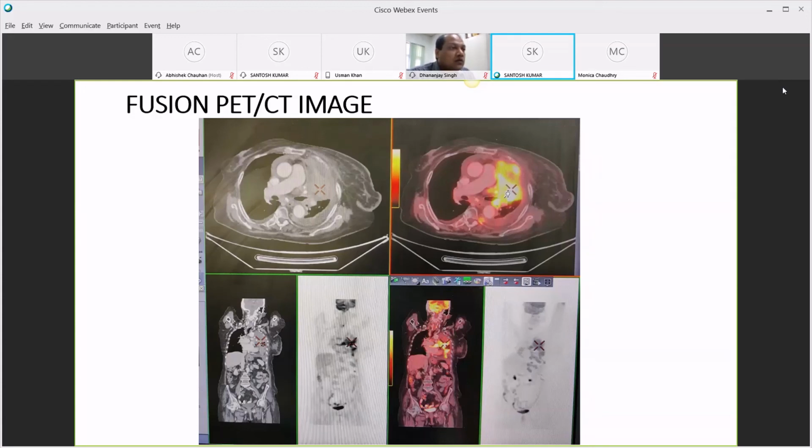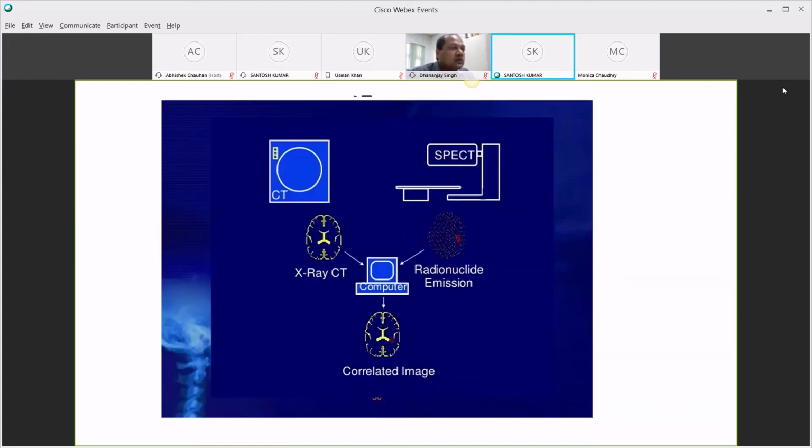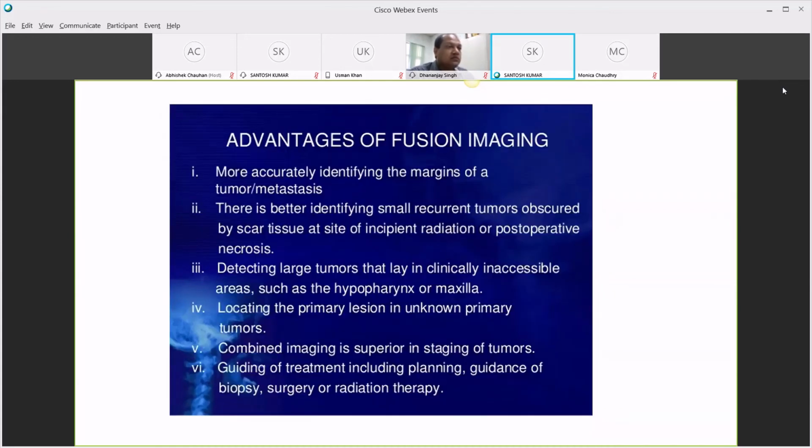There has to be some way, and everyone has to have access, to give more information to the clinician and for technical research. It is required that we have multimodality fusions or hybrid fusions or different fusions with the different modalities.